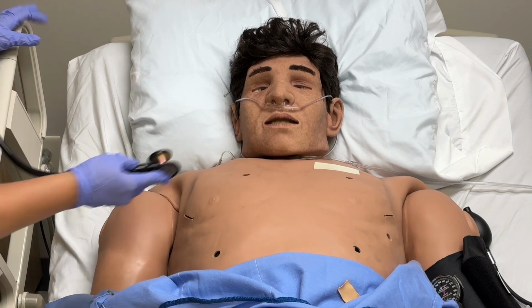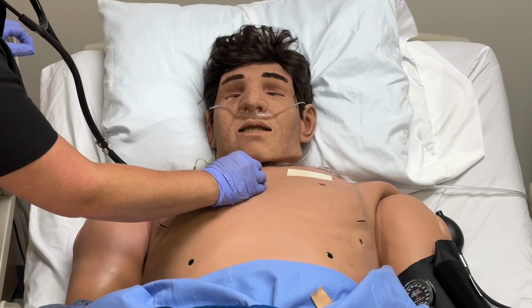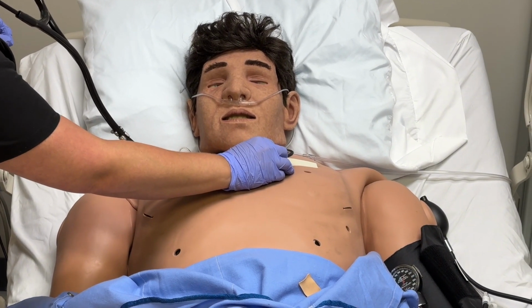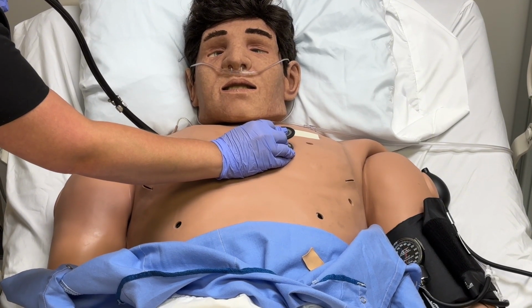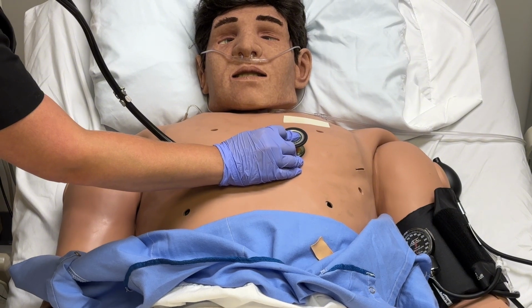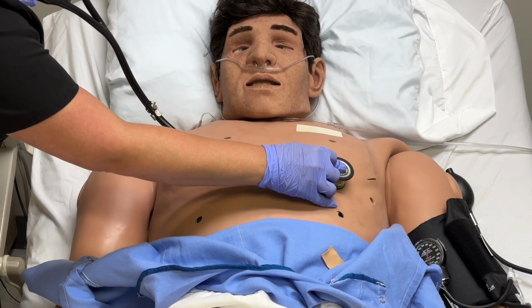And then I'm going to listen with the bell side of my stethoscope. Aortic, pulmonic, Erb's point, tricuspid, mitral, and apex.